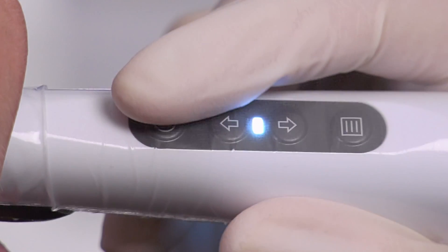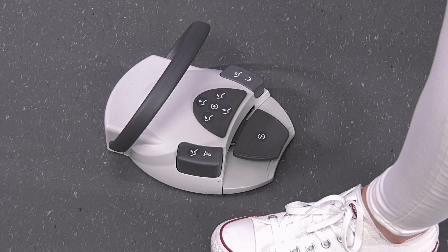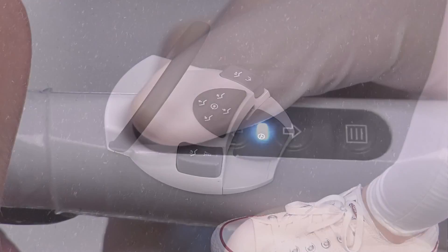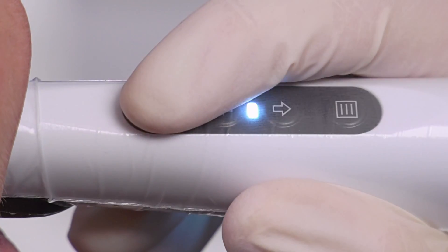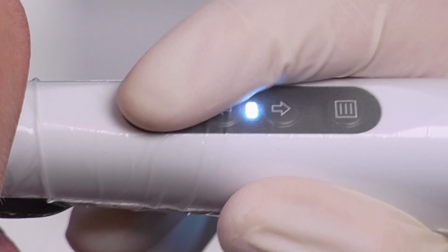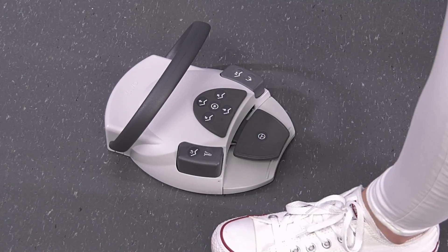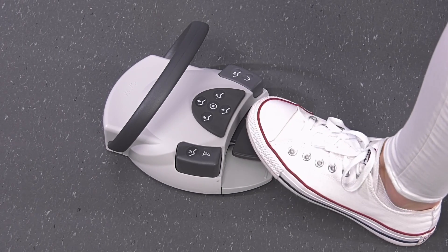The camera can be operated either via the control panel or using the foot control on your CAWO treatment unit. To take a picture, briefly press the release button on the camera or the pedal of your foot control once.